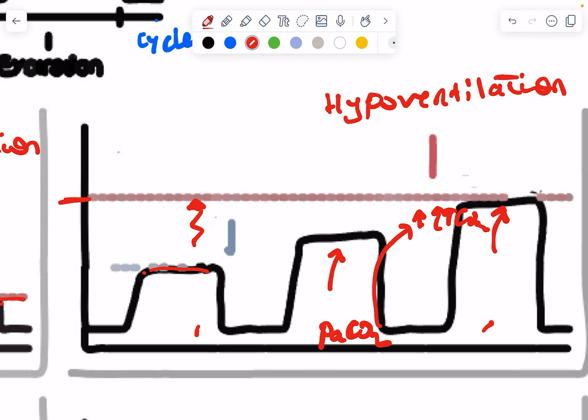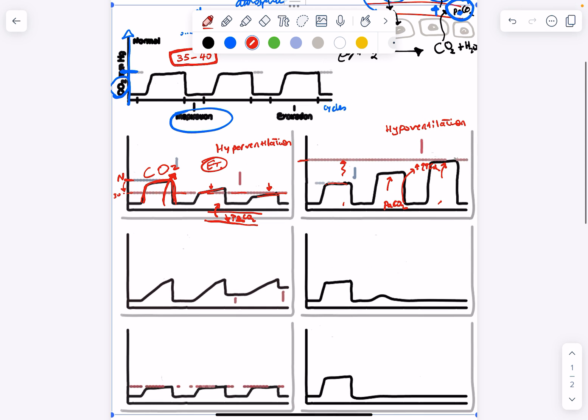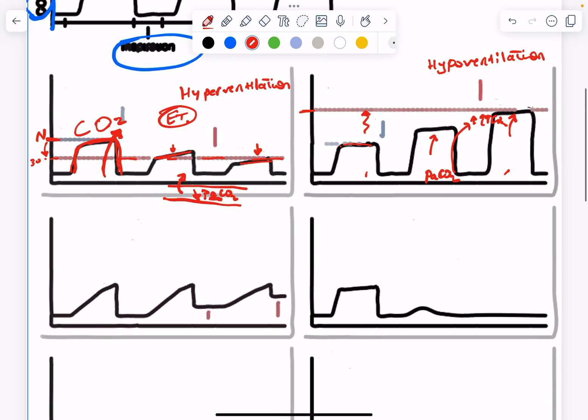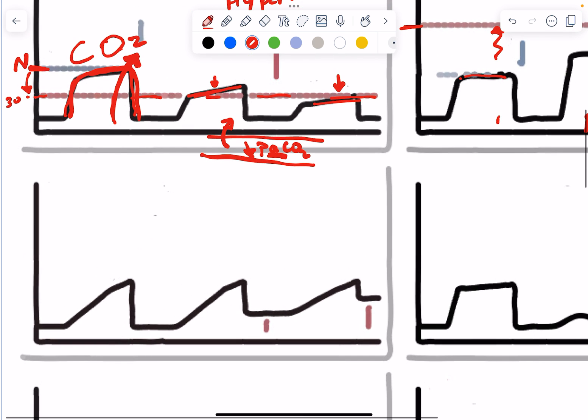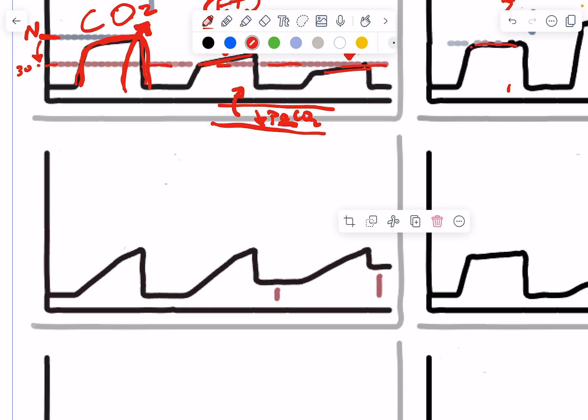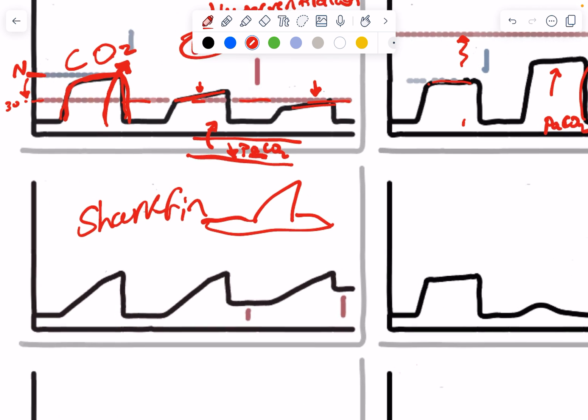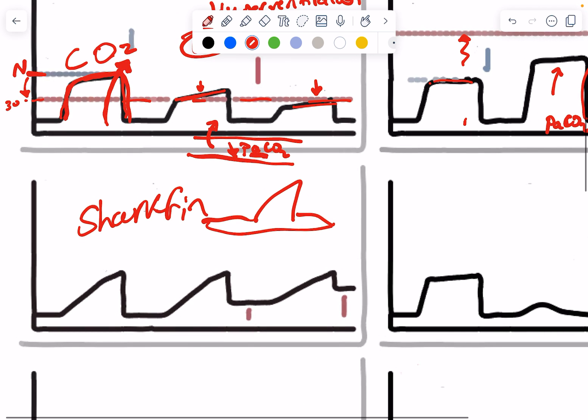Now, let's take a look at another waveform. Take a look at this. Oh, my God, what's going on? The waveform is no longer square. The waveform is called a shark fin appearance, like this shark fin.